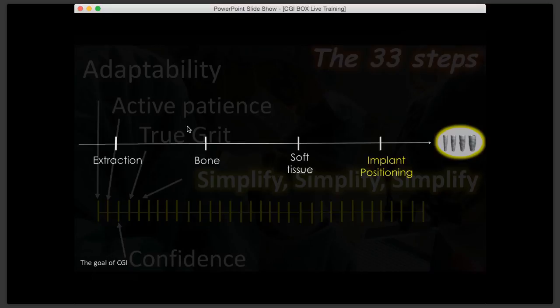So first of all, just to know the critical points to fit in between the teeth, it needs to have some space. It cannot touch teeth. It cannot touch another tube if you're placing implants that are side by side.